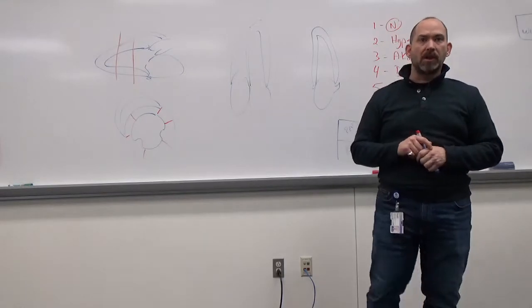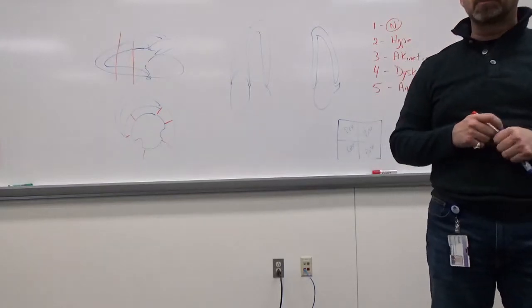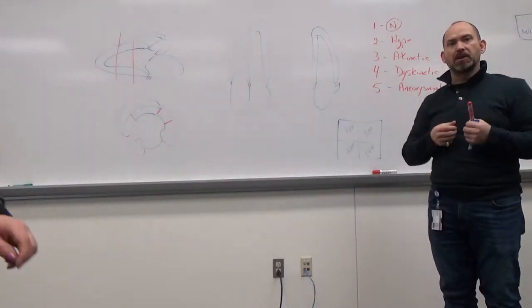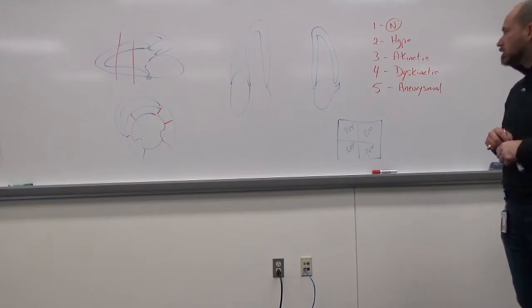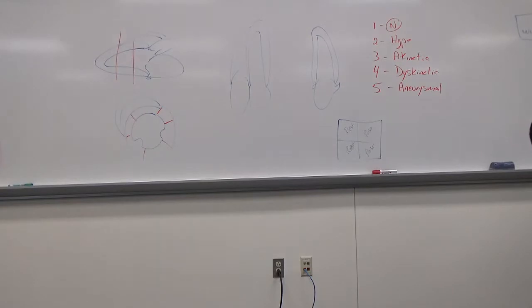So when we say contrast, they get pretty apprehensive, when in reality it doesn't have the same effect at all. We're using a lipid-based shell and an inert gas, so things that don't affect the body in a negative way. The contrast agents that we use are not the same as a CAT scan, CT type of contrast. Okay, so know the different types of stress echoes, know the advantages and disadvantages of each. Know the wall segments, know the coronary artery supply to each of the walls, how to score it, the layout of it.